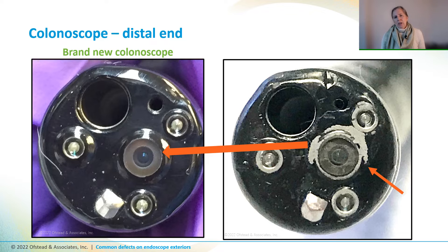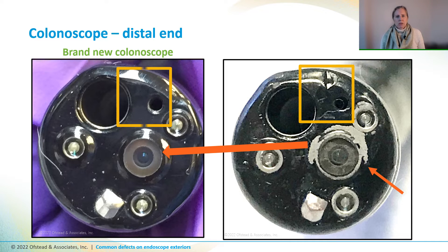In addition, the end cap has impact damage and there may be a crack between the auxiliary water channel outlet and the instrument channel outlets.